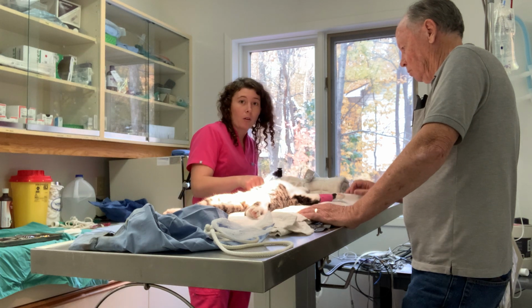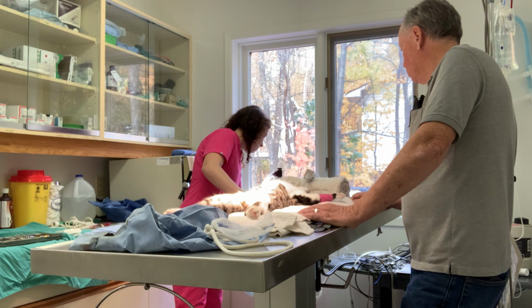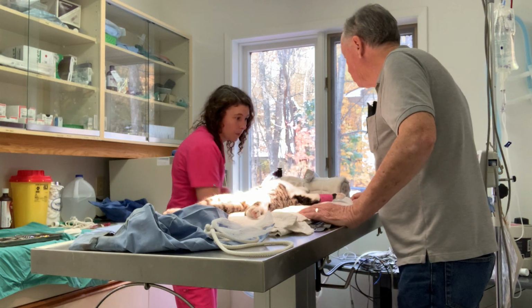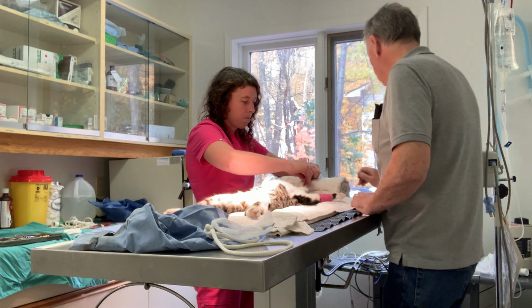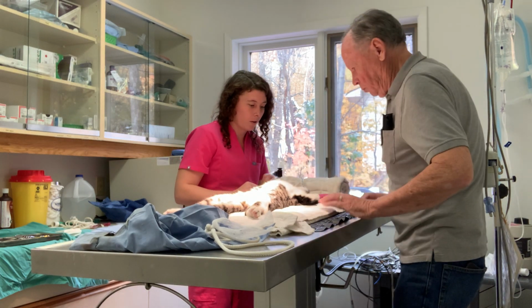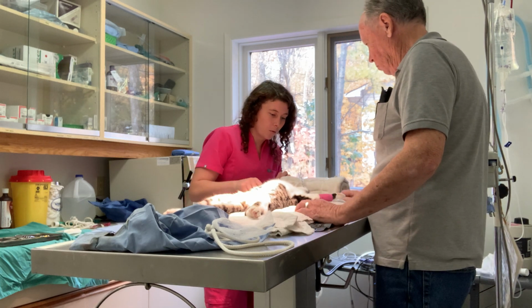We're starting to get our patient to wake up a little bit here, so I'm going to now turn the oxygen off. Our oxygen is off, and we're disconnecting here. Perfect. Thank you for turning the flow meter off there as well. And now we're just breathing a little bit of room air here as we're waking up.